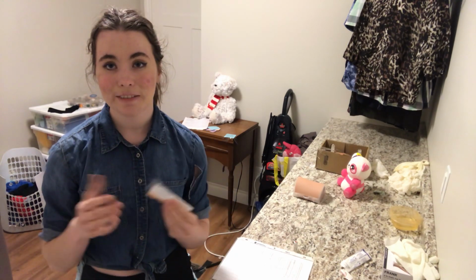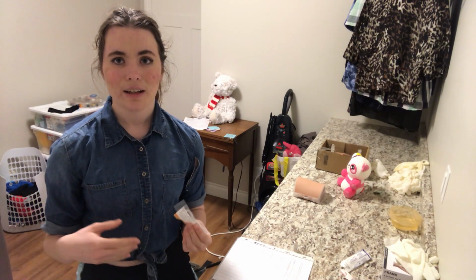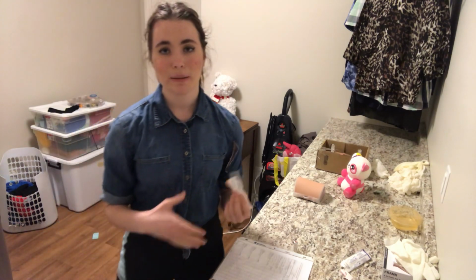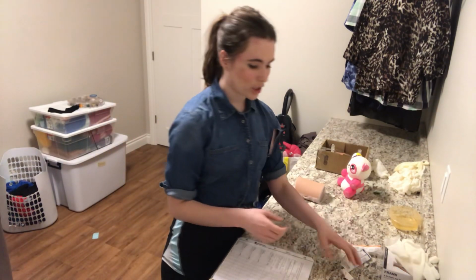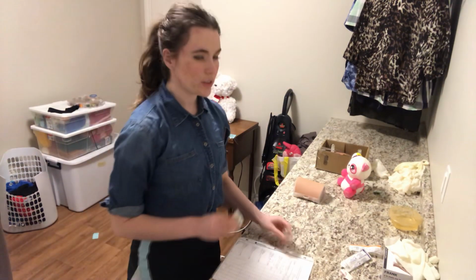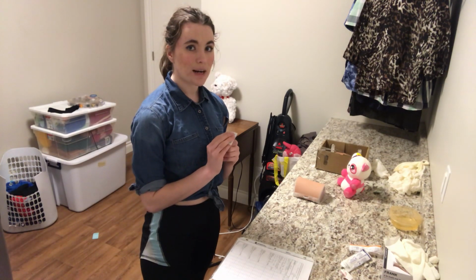I chose this one because it fits within the subcutaneous parameters, and also I have in the scenario made my patient larger, so I wanted to choose a needle that is on the longer side of the subcut spectrum. If my patient was skinnier, I might go down to a 1/2 inch, and I would adjust accordingly. And then lastly, I've also got my blunt fill needle, which is not a filter needle since we are using a vial.